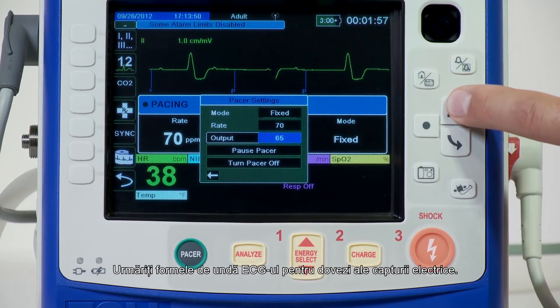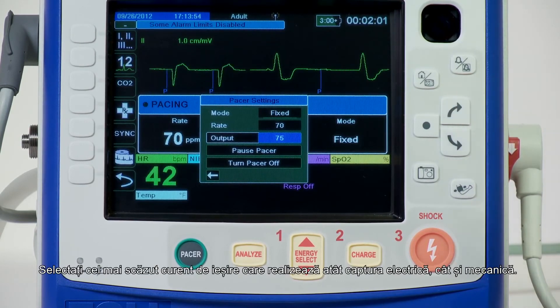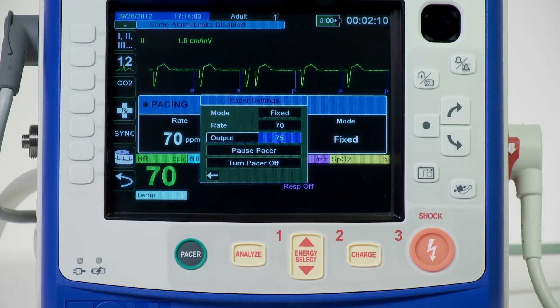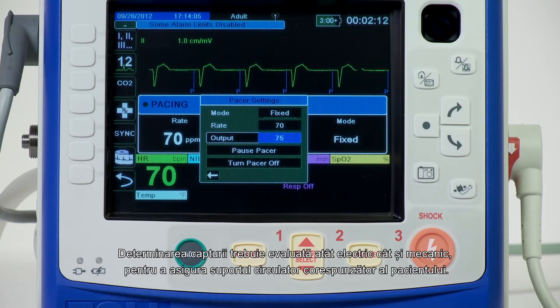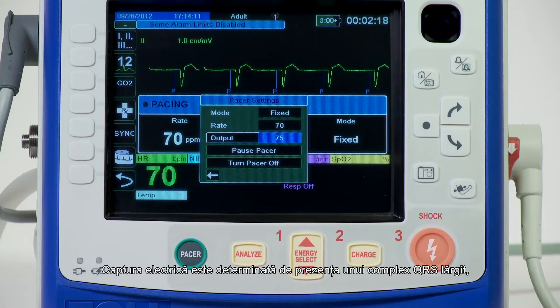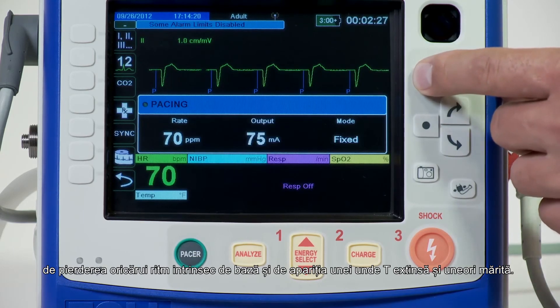Observe the ECG for evidence of electrical capture. Select the lowest output current that achieves both electrical and mechanical capture. It is important to recognize when pacing stimulation has produced a ventricular response or capture. Electrical capture is determined by the presence of a widened QRS complex, the loss of any underlying intrinsic rhythm, and the appearance of an extended and sometimes enlarged T-wave.